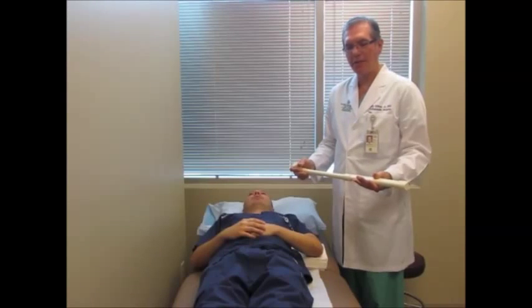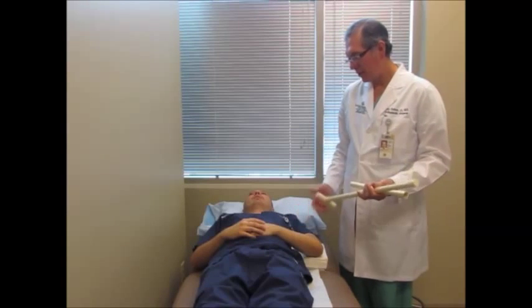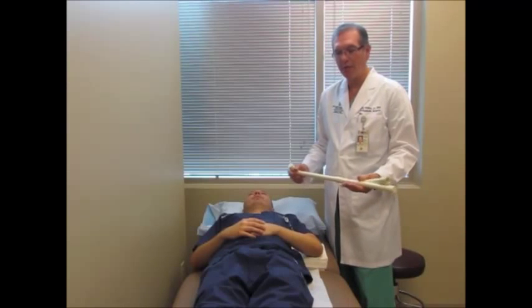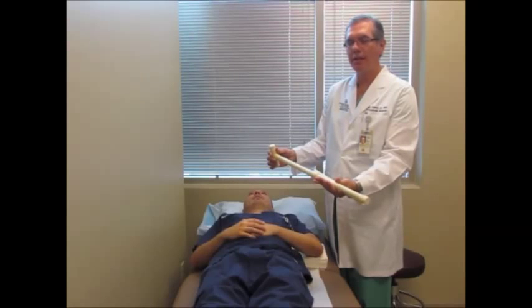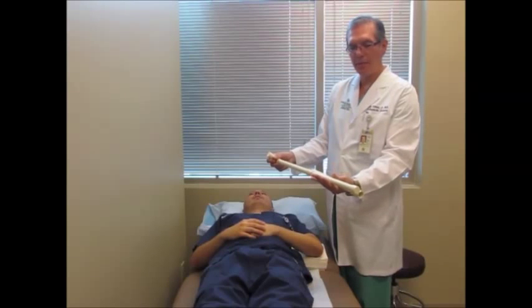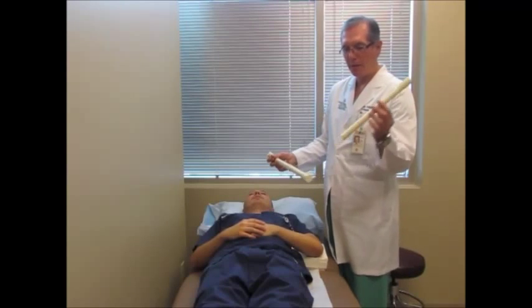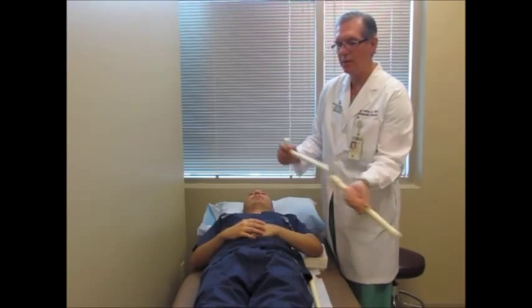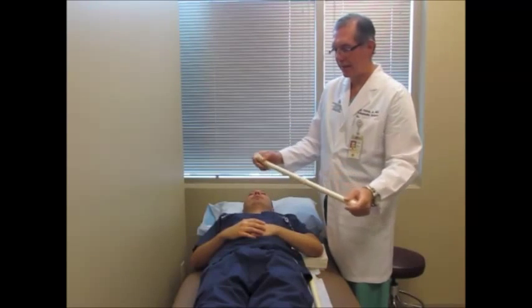The first exercise we're going to demonstrate is passive external rotation of the shoulder. Our model here is Brandon Del Bosque, my PA, and he's going to show you how to do this. This is in your shoulder therapy kit — it comes in three pieces, but I don't want you to use all three pieces. Disregard the middle piece, and attach the handle — the part with the T — to the end, which is the part with the plastic end.